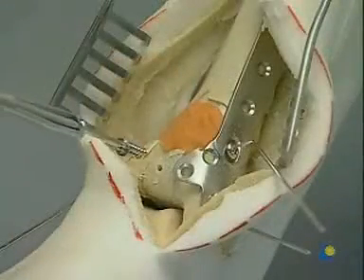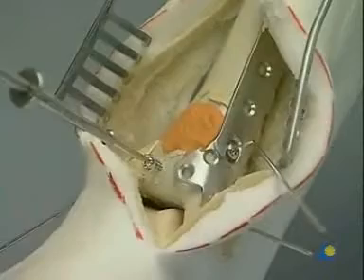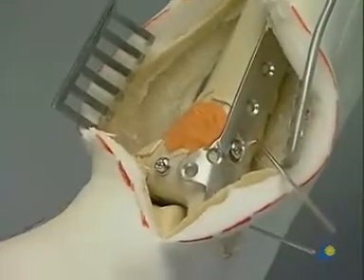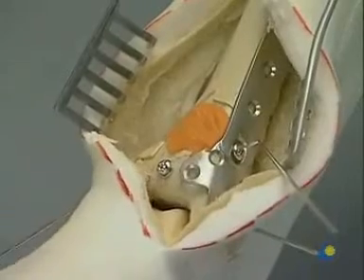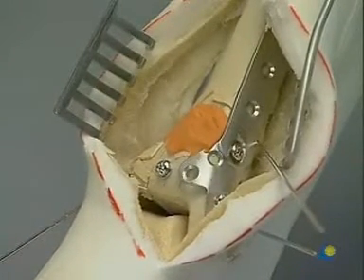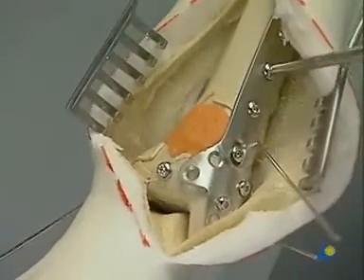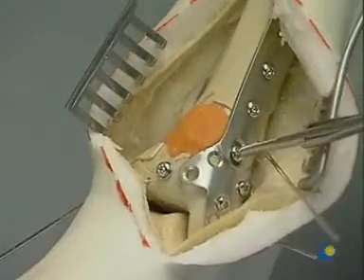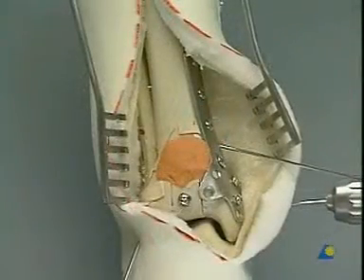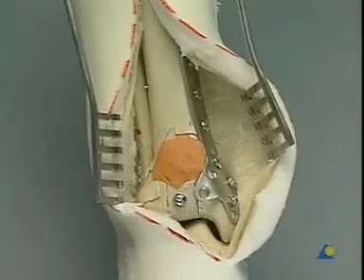To secure the fragments in the frontal plane, a cancellous screw with washer is inserted in the AP direction. Finally, the plate is fixed to the shaft by three 3.5 millimeter cortical screws. Once all screws have been tightened, the K-wires are removed. Another x-ray control should be made.